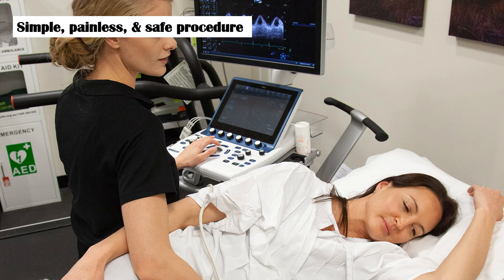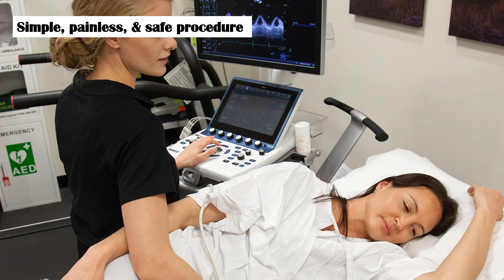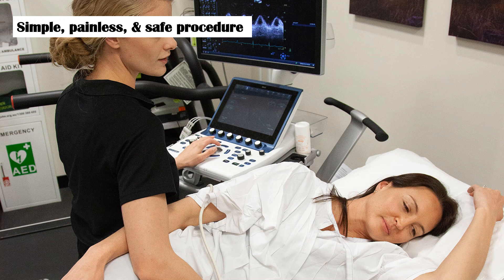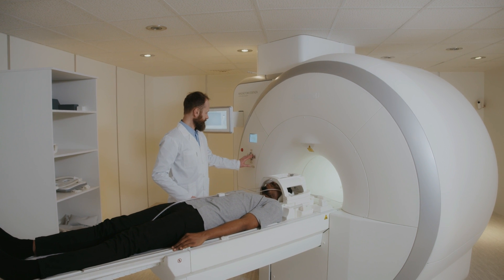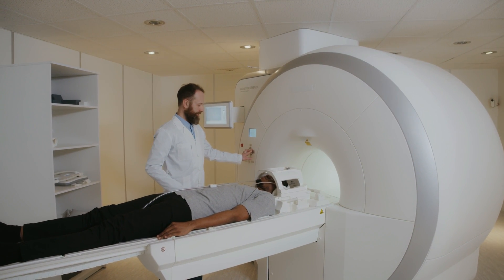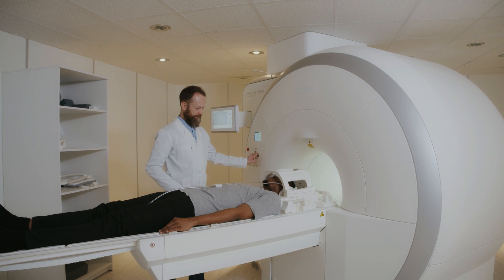A standard echocardiogram is a simple, painless, and safe procedure. Although the lubricating gel may feel cold, and patients may experience some minor discomfort when the electrodes are removed from the skin. Unlike some other tests and scans such as X-rays and CT, no radiation is used during an echocardiogram.